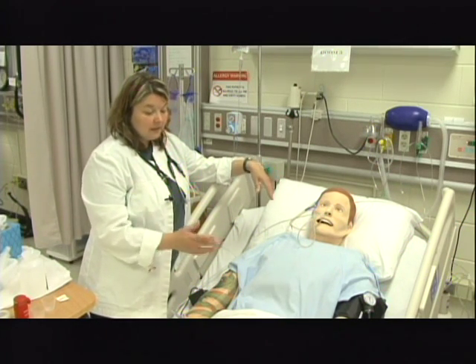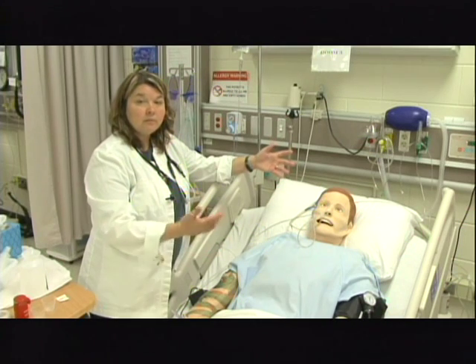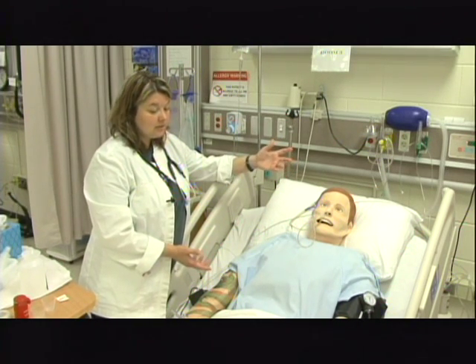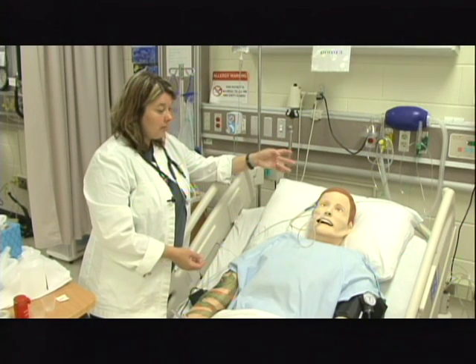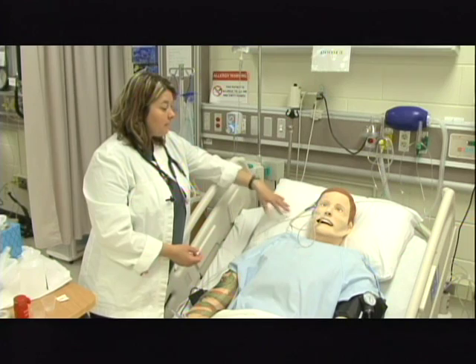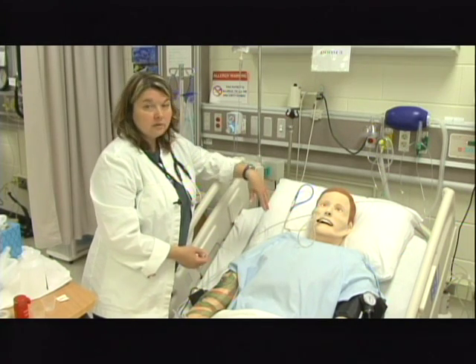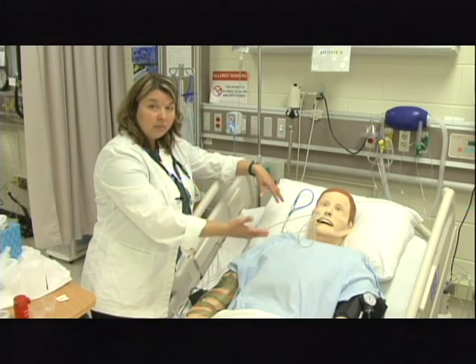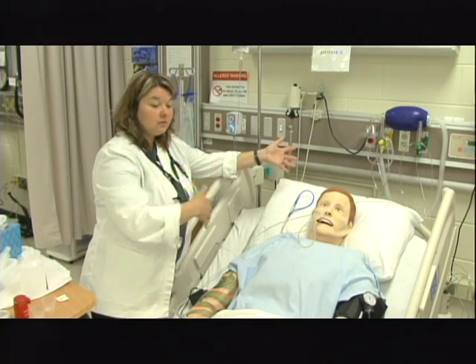And then, of course, if I did the pre-assessments, as I said, I'd want to come back in 30 minutes and do reassessment. So, for instance, if I gave him medications that would affect his blood pressure, heart rate, or any of those kind of things, I'd want to come back and reassess those and for his tolerance. Also, if he is ordered to be on suction, I would need to come back in 30 to 45 minutes, again, recheck placement, and then reestablish his suction as ordered.